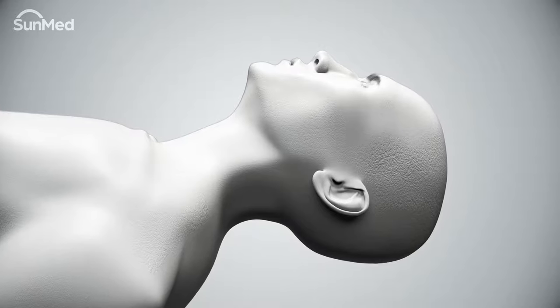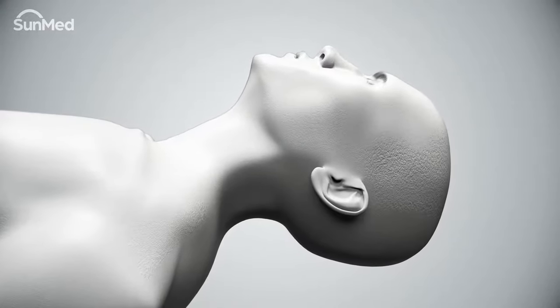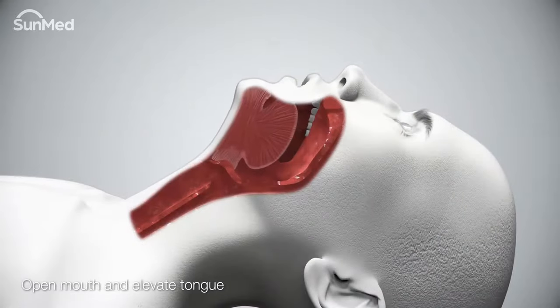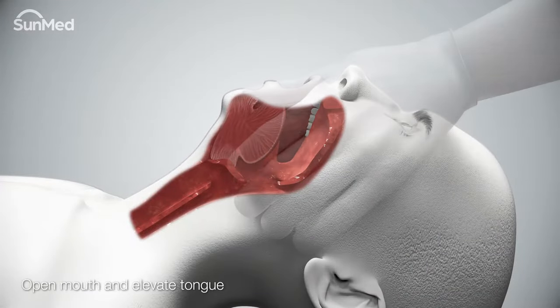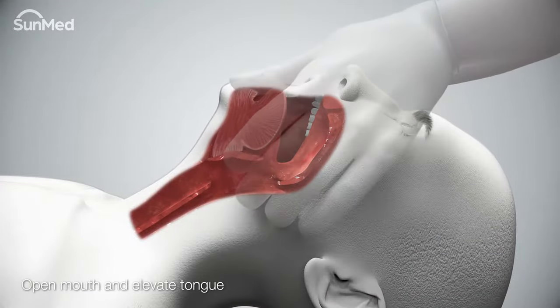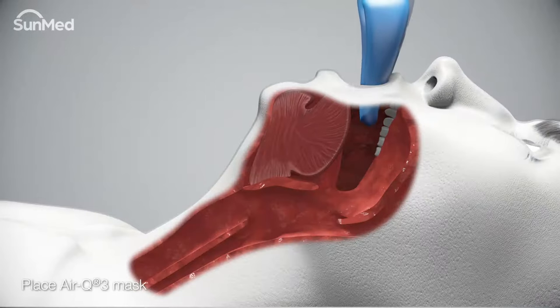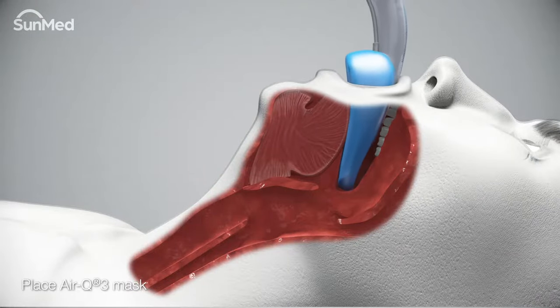Open the patient's mouth and elevate the tongue. A mandibular lift is recommended. A tongue blade placed at the base of the tongue may also be used. Place the front portion of the air Q3 mask between the base of the tongue and the soft palate at a slight forward angle.